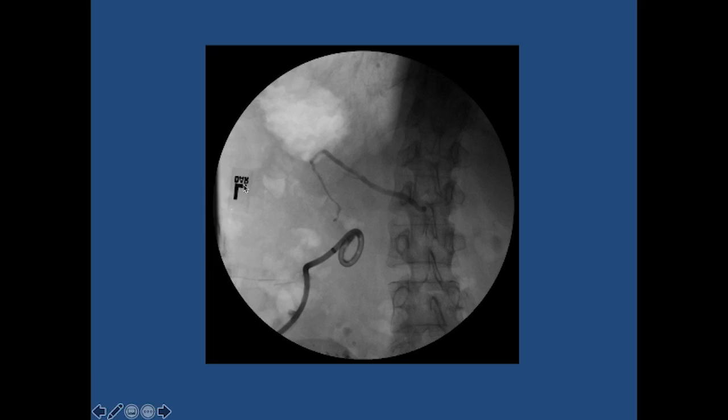In many instances, some operators and surgeons would prefer that the drain in these situations be backed away slowly from the area of communication with the pancreatic duct. There is some belief that a drainage catheter adjacent to the source or area of leak may reduce the healing effect of the hole that's present there. So you may find yourself in some situations being asked to back away this catheter slowly, week by week or every 2 weeks by a centimeter or two, hopefully allowing the tract to close.